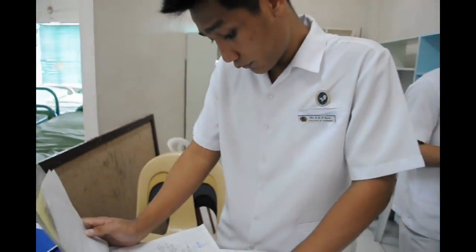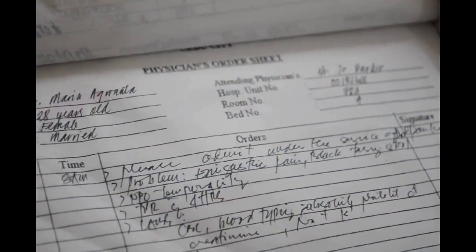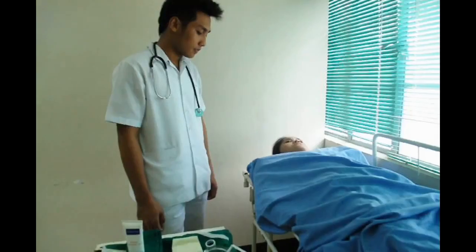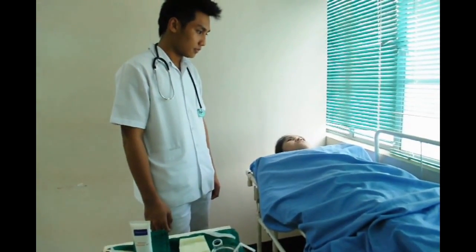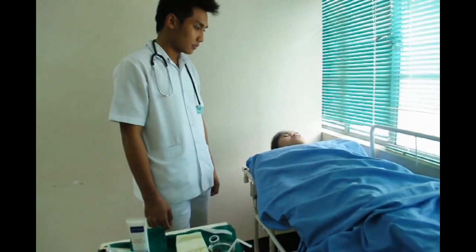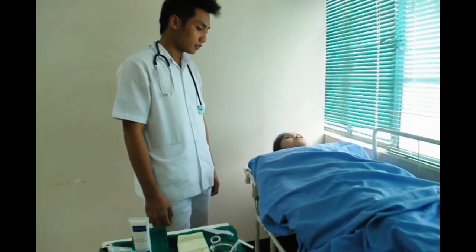The patient is for NGT insertion. After checking the physician's order, Nurse Christian is going to identify the patient. Identification of the patient ensures the right patient receives the ordered procedure.